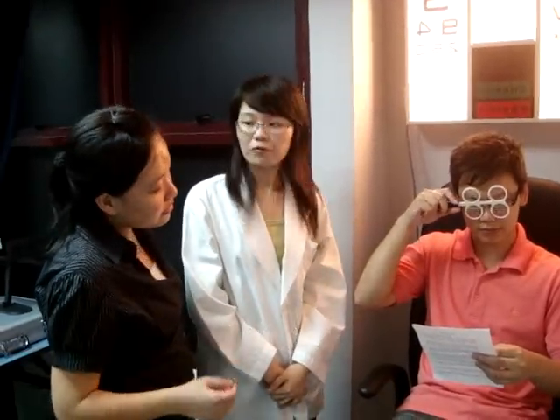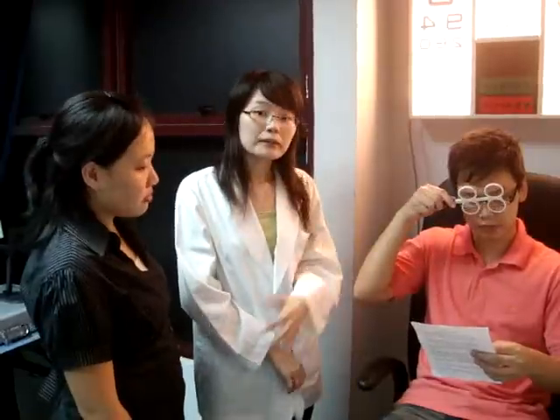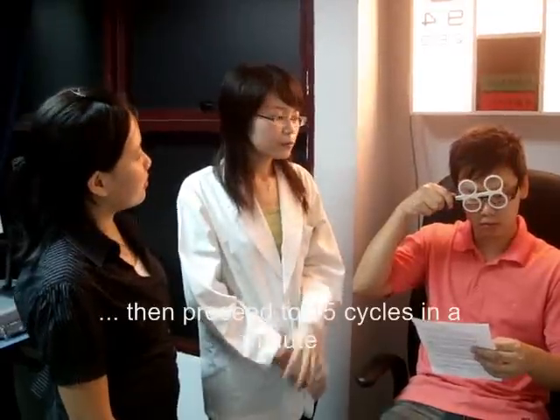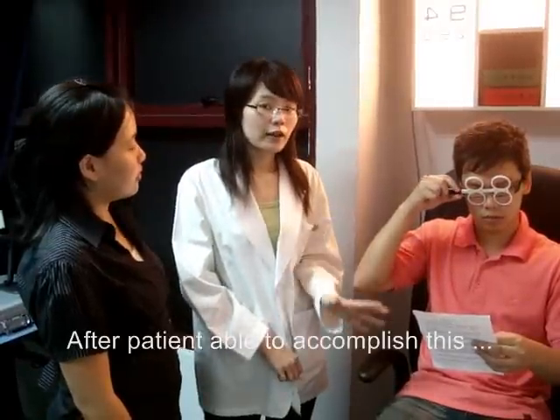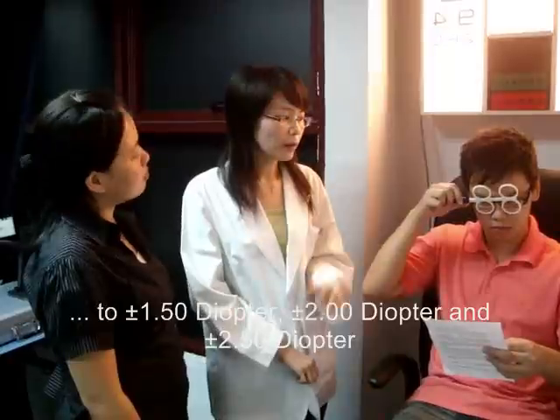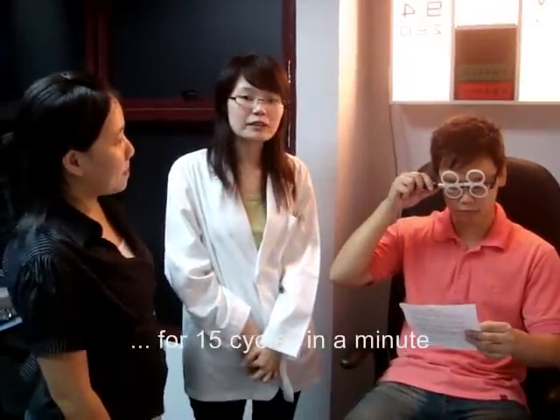Is that all? Of course not. I will then increase the power of the flippers to plus-minus 1.0, and we will repeat the same thing — 15 cycles without time limit first, then 15 cycles within a minute. After the patient accomplishes that, we increase again to plus-minus 1.5, then plus-minus 2.0, and so on up to plus-minus 2.5. This therapy continues until the patient is able to successfully clear the plus-minus 2.5 flippers for 15 cycles within a minute.